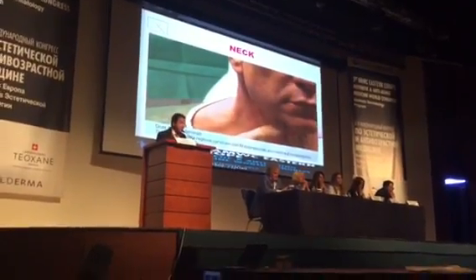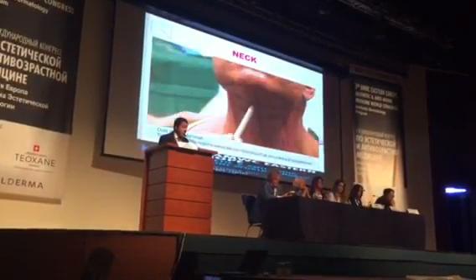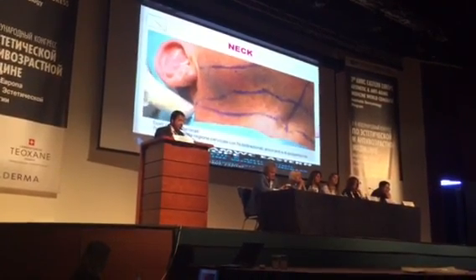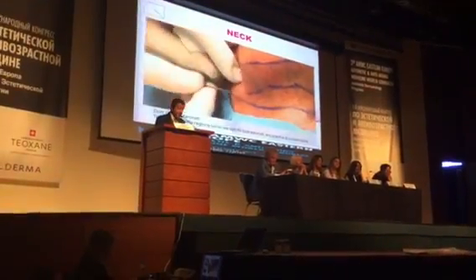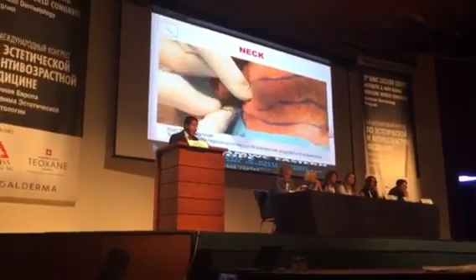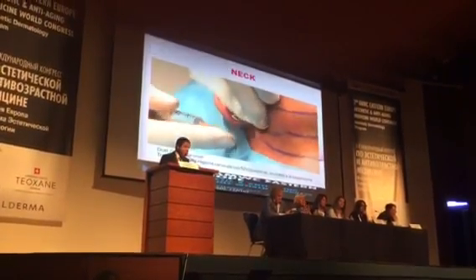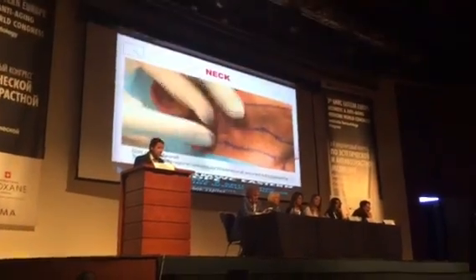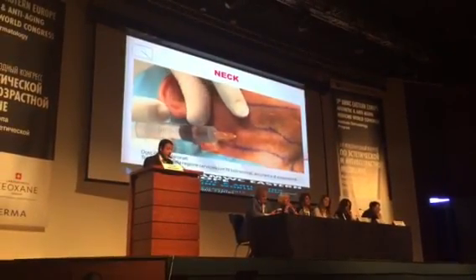I mark the mandibular area, I mark the skin laxity of the neck, I observe my patient in the side position, and I mark the more ptosic tissue. Then I make a local anesthesia above the ear. Usually I go above 2 centimeters, and then I go 1 centimeter behind. That I make a local anesthesia.